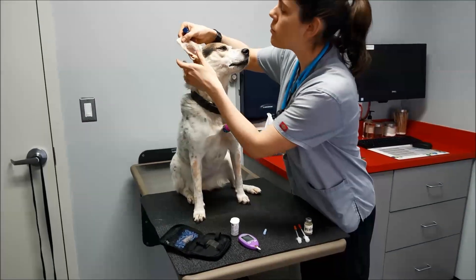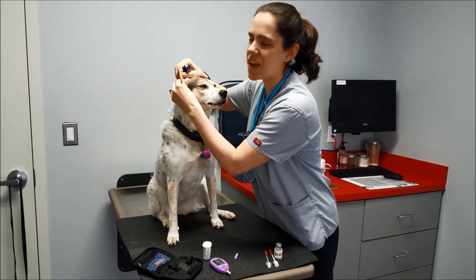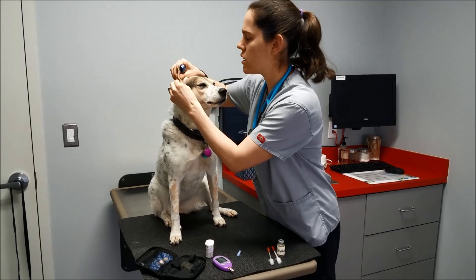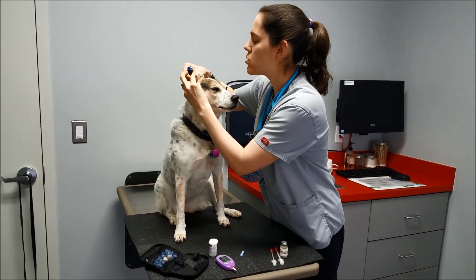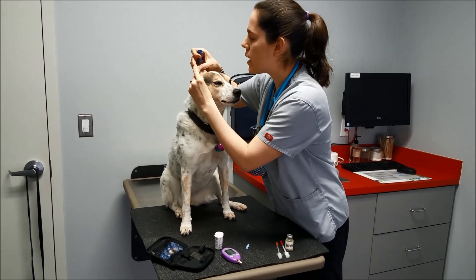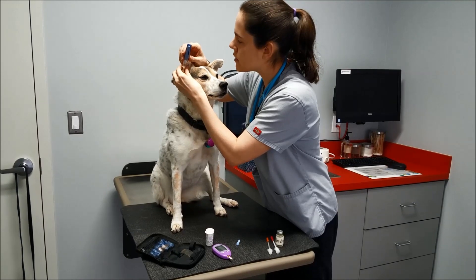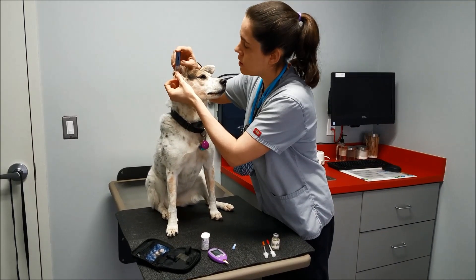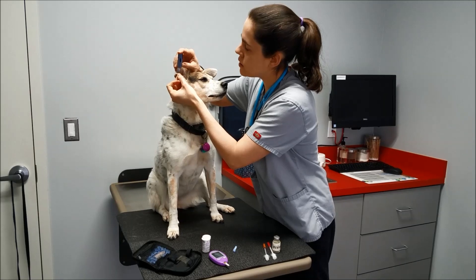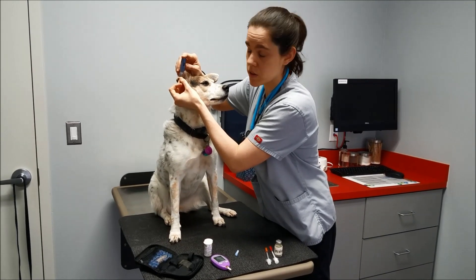We're gonna choose a place on her ear to get to. Massage the area, kind of desensitize it, and also get some blood flowing in that ear. We'll choose right about here. I like to hold my finger underneath to give it some stability and press the button. I also like to hold it in place for a little bit because it creates a little bit of suction there.